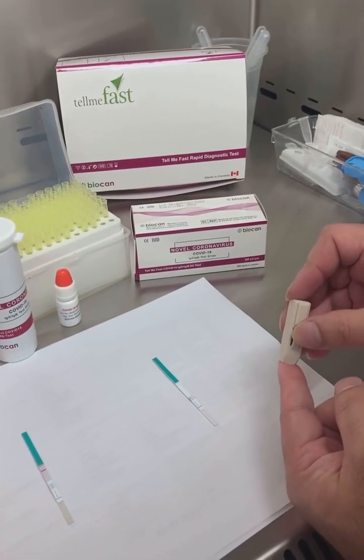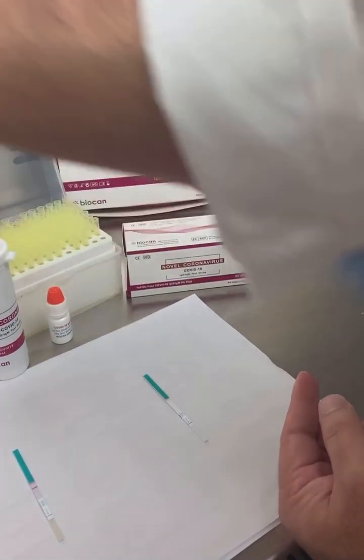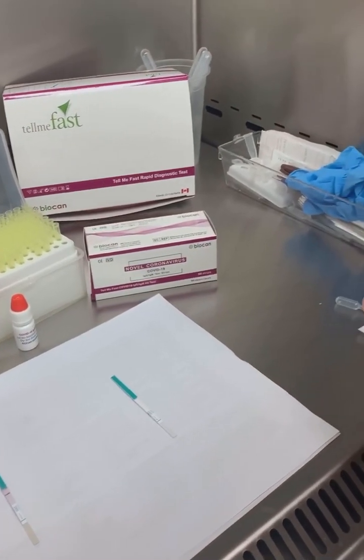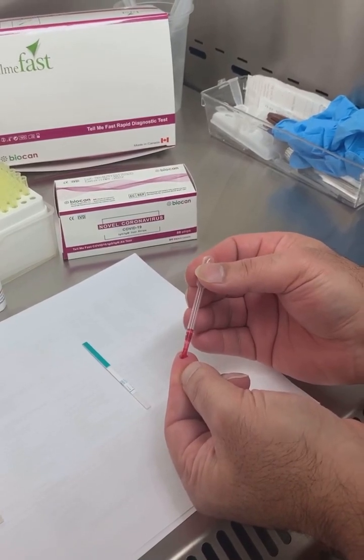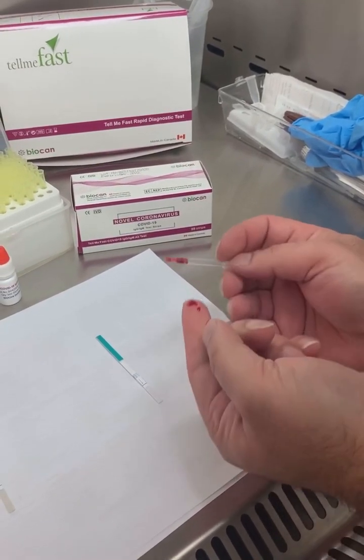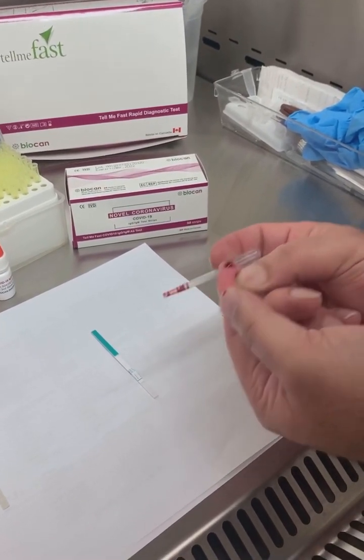Now we're going to be performing the test using the finger prick whole blood. With a lancet, prick your finger. With a pipette, take 20 microliters of whole blood and dispense it on the sample pad of the test strip.